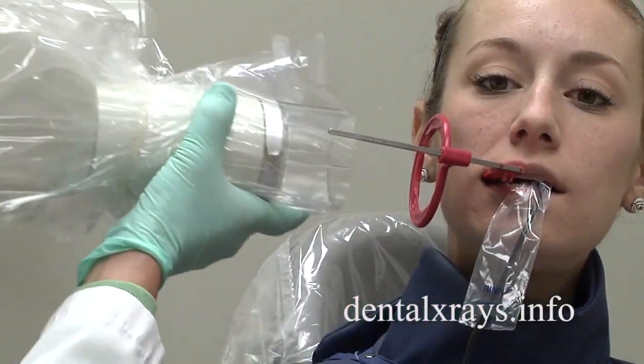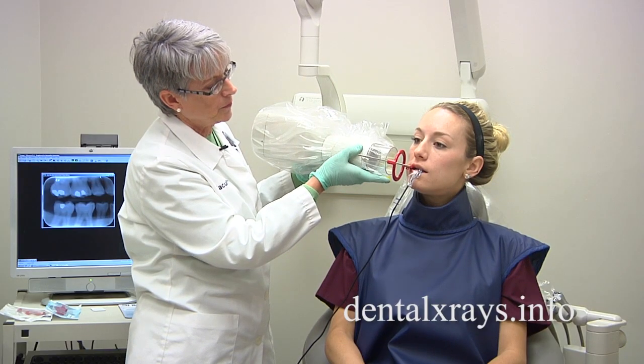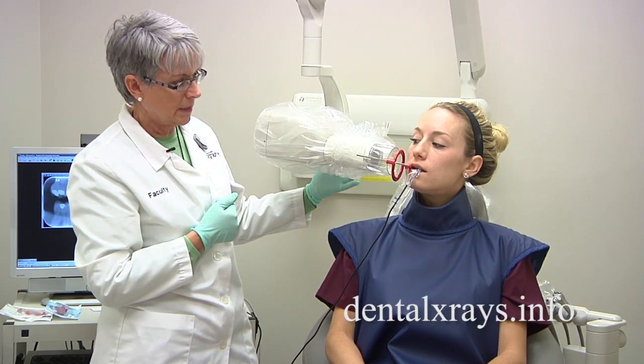Now again, I don't want to come like this. I want to come this way, thinking outside the circle and taking the view like this.